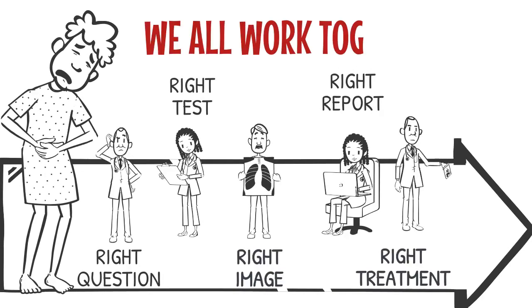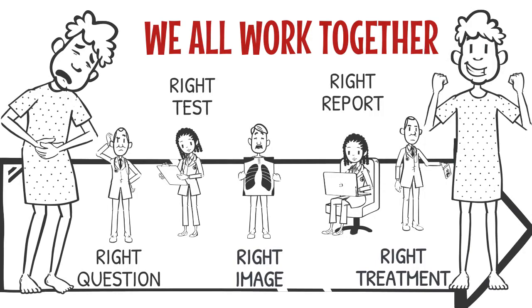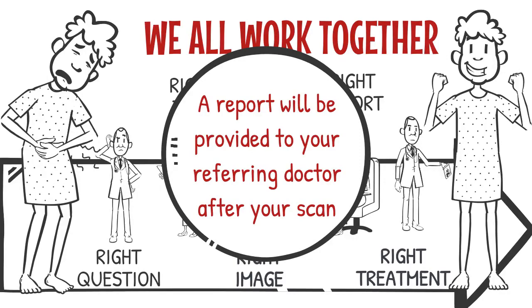Whilst the radiographers are highly trained, it will be another member of staff, usually a radiologist, that will report on the images. Therefore, they will not be able to provide you with any indication of the results at the time of the appointment. A report will be provided to your referring doctor following the scan, who will go through the results with you and discuss with you any plans for future treatment.